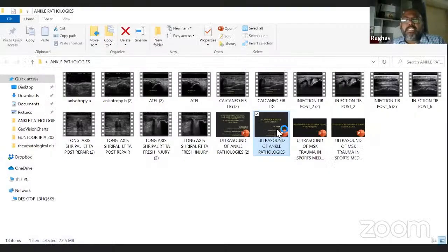And what I do when I do that, the jelly, should I show you in the slide? If you want me, I can just show you in the slide. What happens is that we make the needle parallel to the probe. So at all times when the needle is parallel to the probe, our visibility is always better. And we actually know where we are injecting. So here we can see that we plan in a way that the needle is going parallel to the probe.